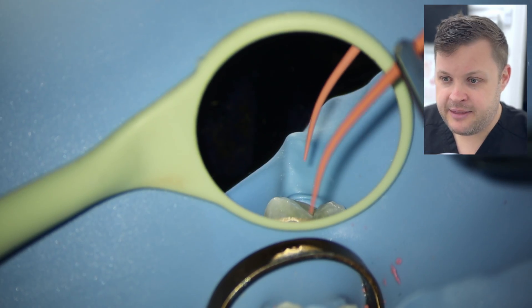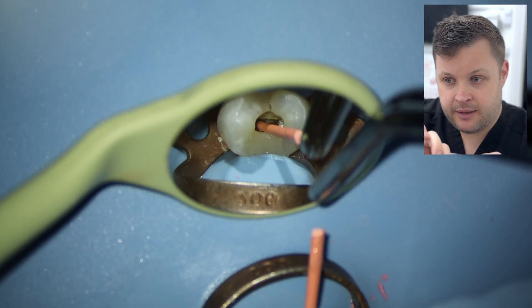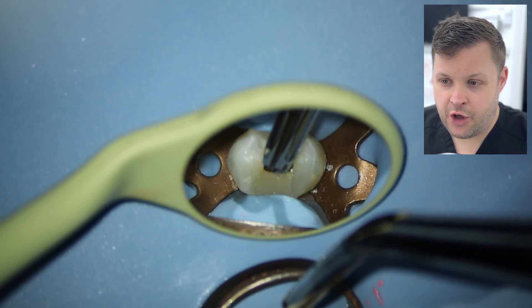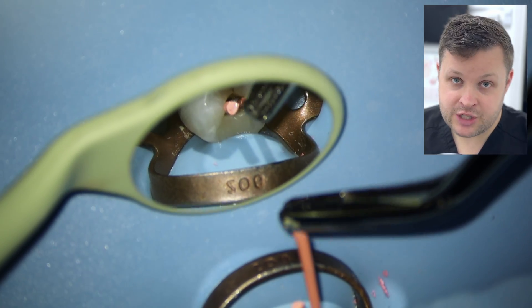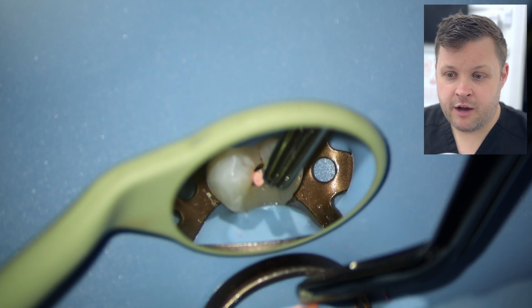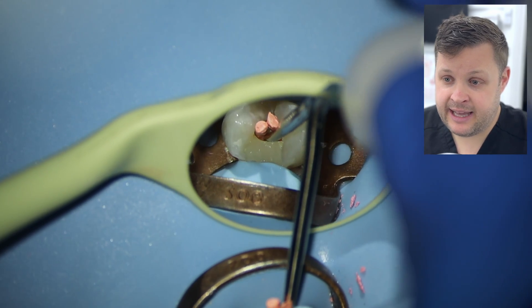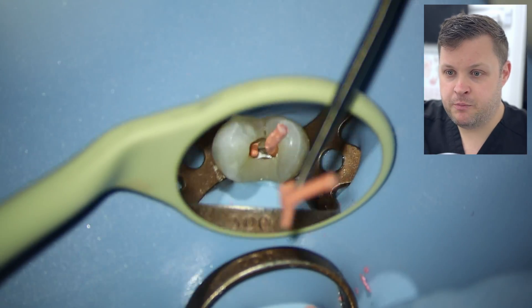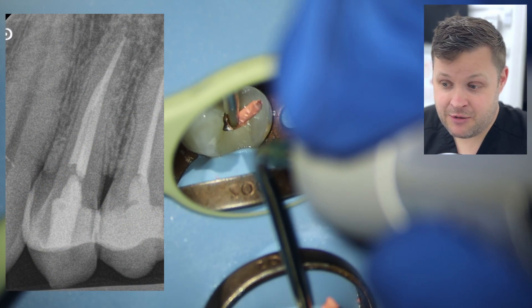When I fill the bioceramic in one canal, it fills the other — further proof that they join. There's a curve in the buccal canal, so I'm making a long bend and pushing the GP point to length very slowly. There's nothing more disheartening than doing all this work and finding your GP point has staged and hasn't reached the end. I push slowly to avoid vapor lock, then shear off the excess GP carefully — using a shearing motion with the heated plugger rather than pulling, to avoid dislodging the GP.